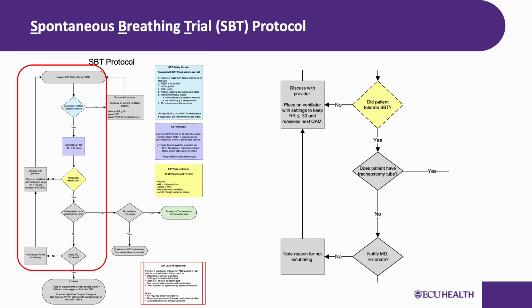When the patient meets extubation criteria, coordinate with the provider to obtain an extubation order if one is not already in place. For patients on protocol, this may be a part of the standing orders, but always verify. You want to make sure everything is lined up before you pull that tube, including having the appropriate post-extubation support ready, whether that is high-flow nasal cannula, BiPAP, or simple supplemental oxygen.